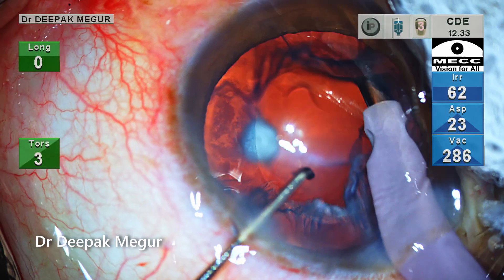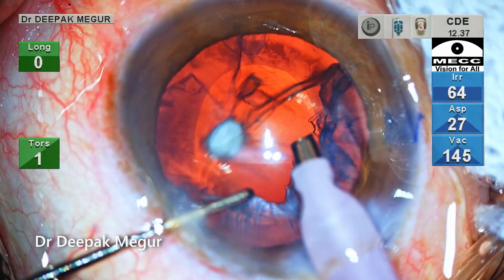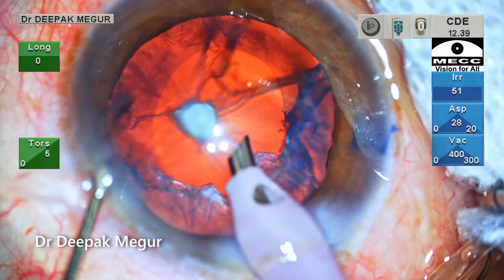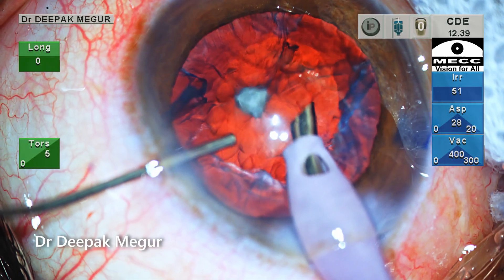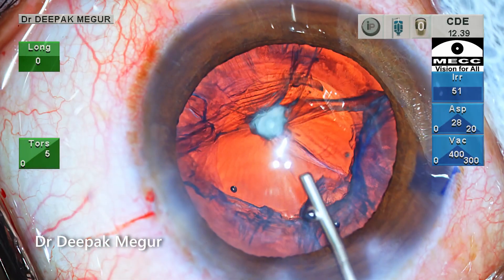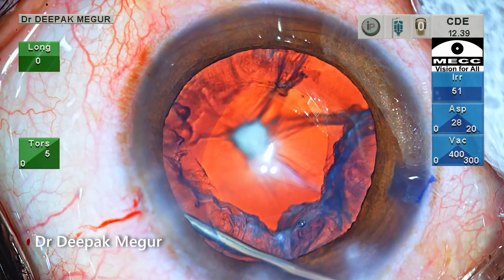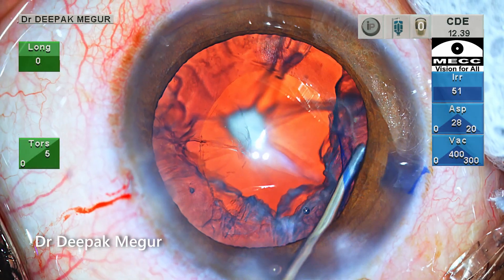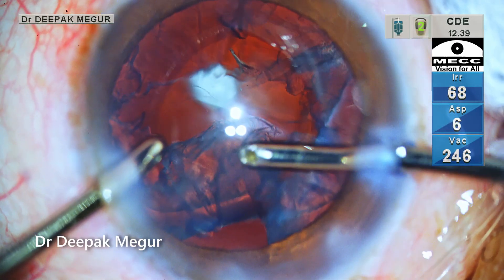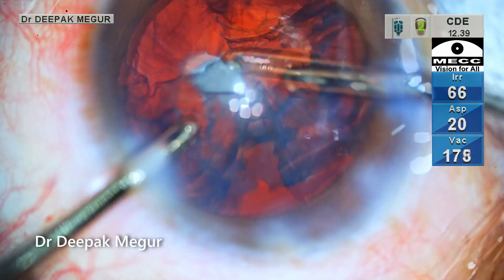The edges of the distal portion of the epinucleus are getting trimmed. Removing the proximal part of the epinucleus as the sub-incisional part is going to be challenging. Before removing the handpiece, OVD is injected into the chamber to prevent shallowing of the anterior chamber. I prefer to perform visco-dissection of the epinucleus, injecting viscoelastic under the proximal sheet of epinucleus and the oval rhexis.